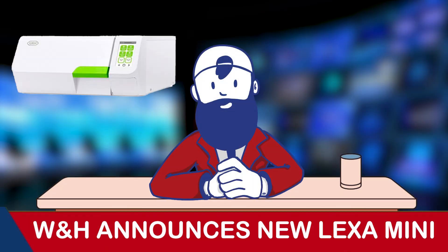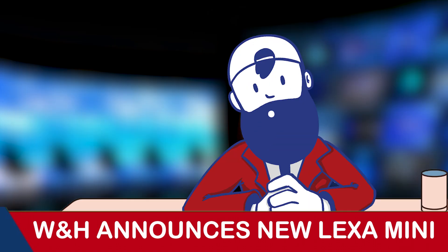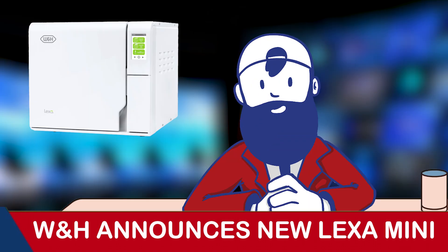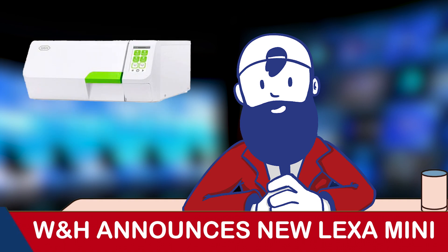The new W&H Lexa Mini is coming soon to the autoclave market, and we've got some information to share with you. W&H already took the industry by storm with their Lexa autoclave line, and now they've taken their winning formula and put it in a compact yet rapid new package with the new Lexa Mini.